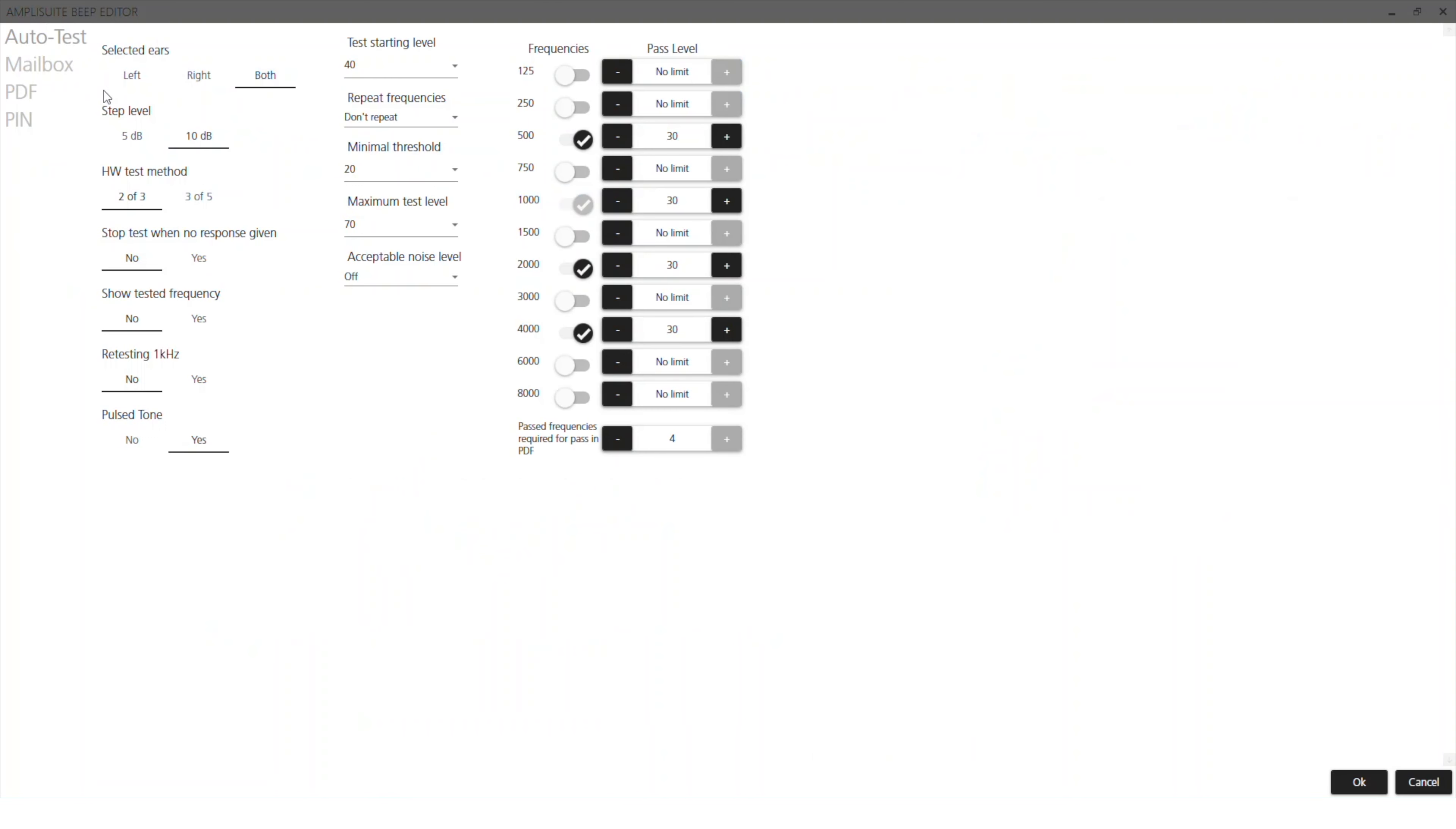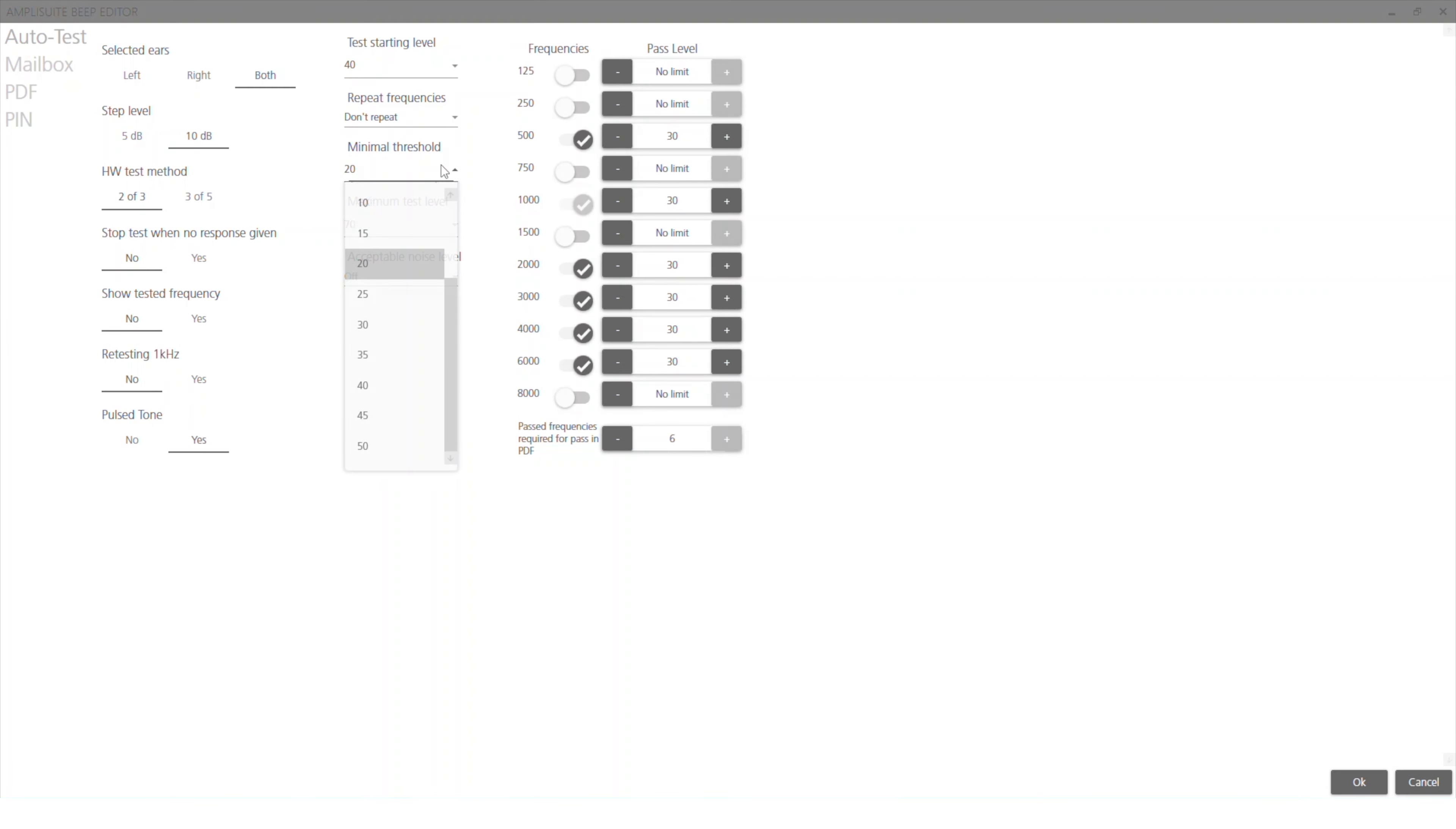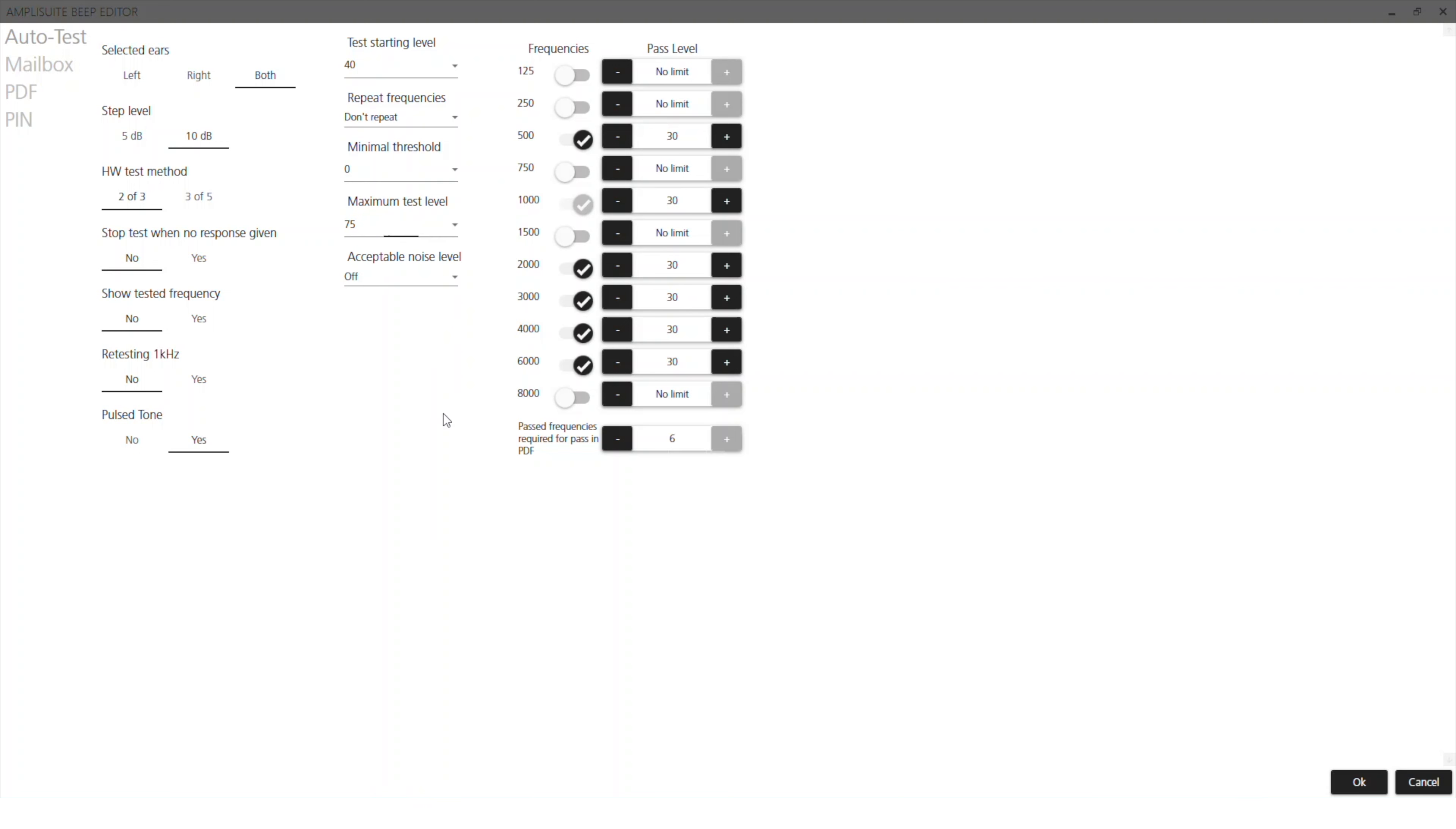The default configuration is for the system to test four frequencies straight out the box. This default criteria can be adapted to either get a faster test or get a deeper understanding of the customer's hearing.